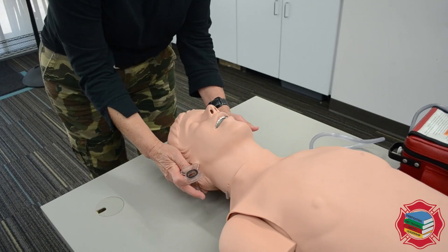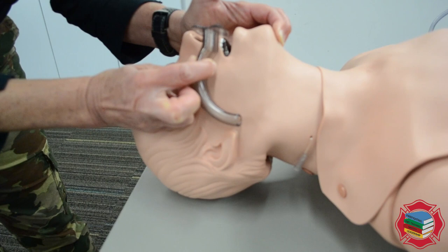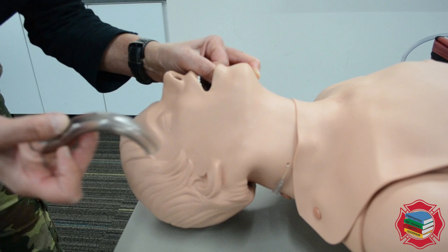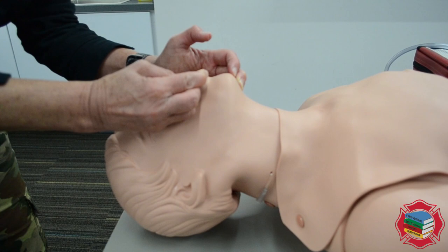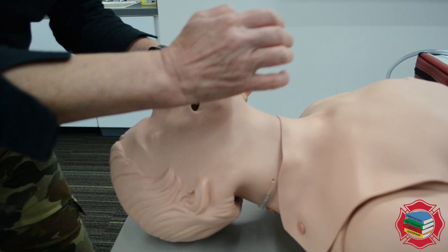I'm going to take my OPA and reopen the airway — seems to be clear. I'm going to measure from the front teeth to the angle of the jaw. Using my cross-finger technique, index over thumb, I'm going in with the OPA inverted. As soon as I hit the soft palate, you'll feel a decrease in resistance, then I'll rotate it 180 degrees. The flange should rest on the teeth or the lips.